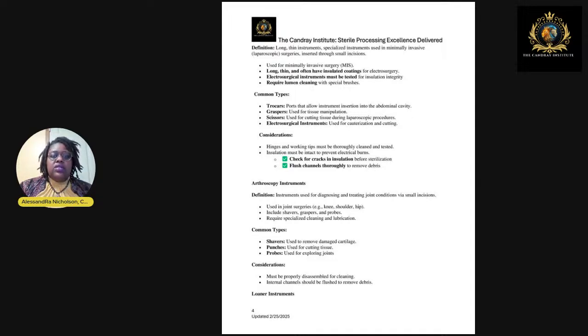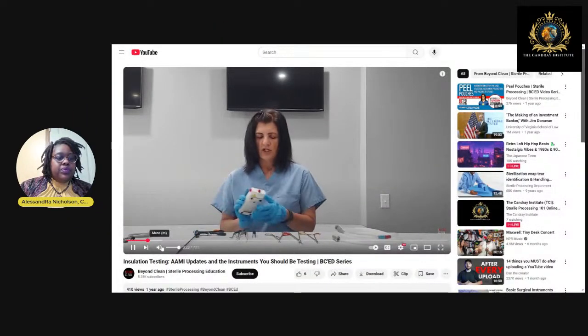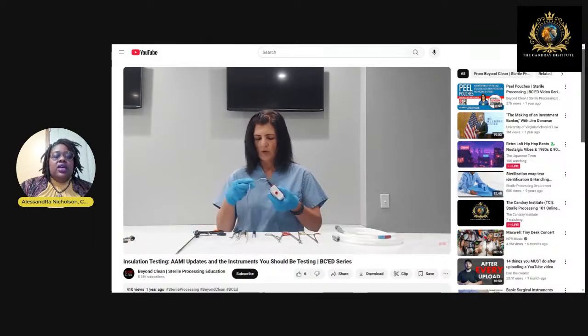Here we go. Insulation testing. Check your tester, make sure you have battery power. Get yourself set up and get ready.